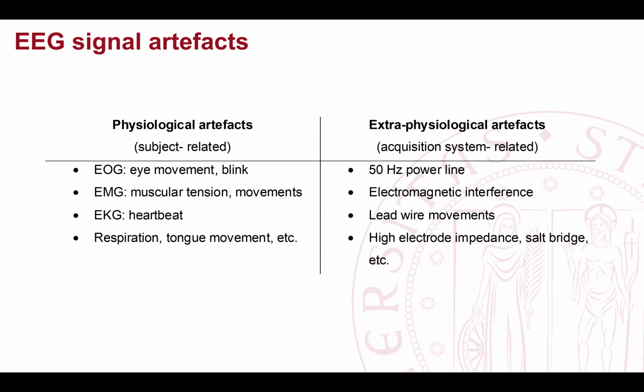Electromyography, in particular of the neck muscles. The muscles produce, for head stabilization, a lot of muscular activity that traverses the scalp and arrives at the EEG electrodes and is recorded by the EEG system. And again, this is noise. This is something we are not interested in. And this is particularly critical in applications where you have movements. When you work with BCI, normally you work with locked-in patients. Locked-in patients are still, so there are not many blinks or muscular artifacts.